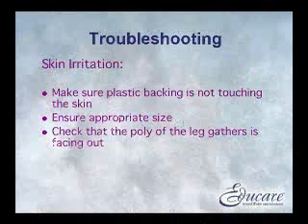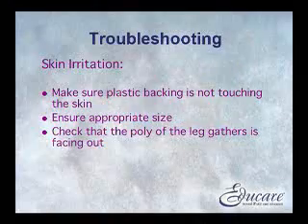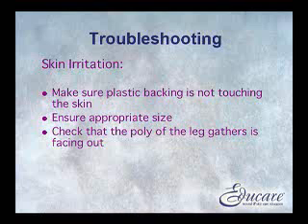If the resident is experiencing skin irritation, make sure the plastic backing is not touching the skin. Check that the product size is correct for that resident. If I go into a facility and every resident is wearing a size large, for example, the first thing I'm going to do is look at the resident and the size of that resident. Is every resident in your facility a size large? Check that the poly of the leg gathers is facing out.